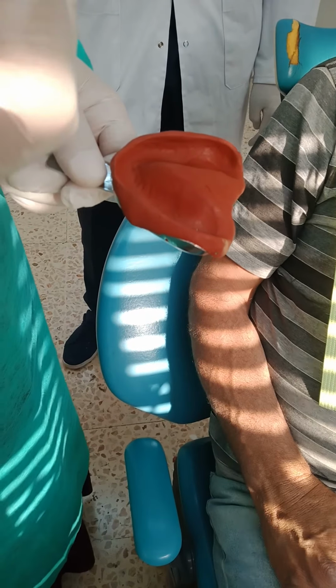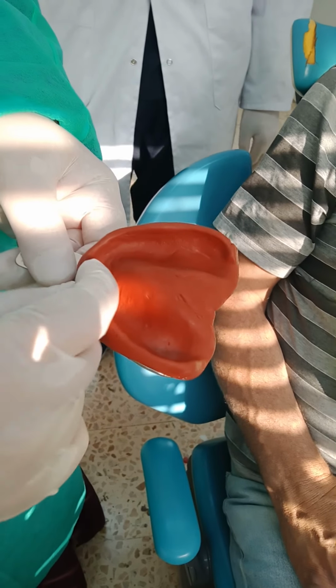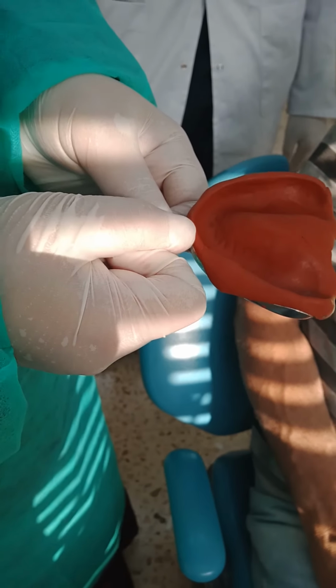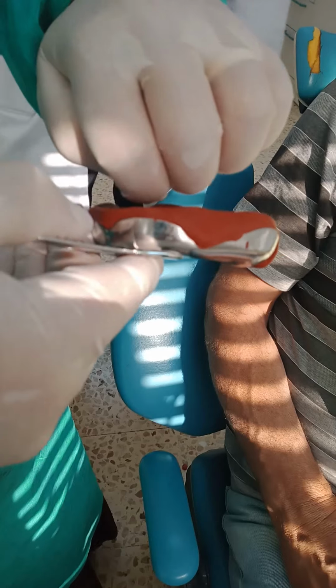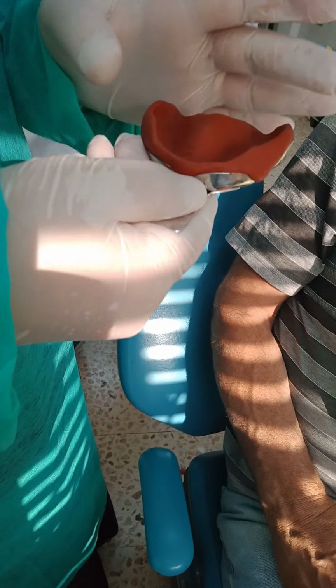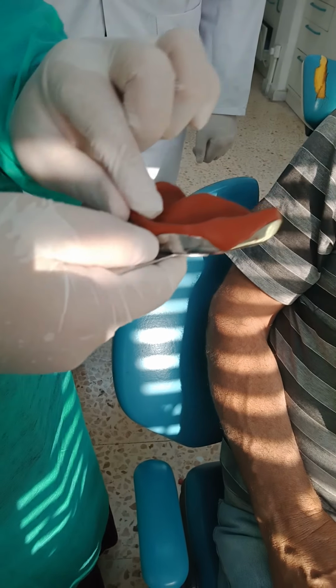First, I want to discuss why this happens, and second, how to treat it. Why did it happen? Because there is not sufficient material here. You see it's very thin. That means the tray, while entering, hit the ridge. The tray was too close to the ridge, so it hit before entering around. This hit will drag the material away and also will not take the sulcus correctly.